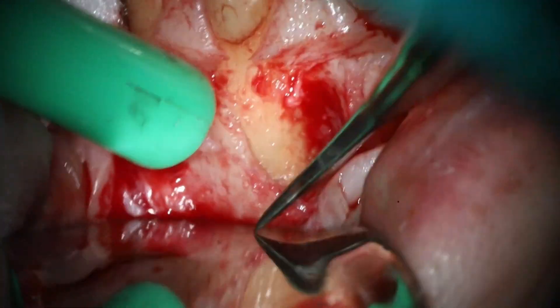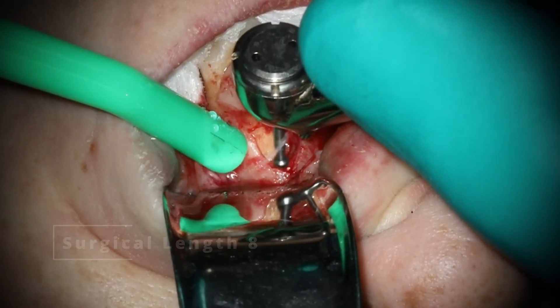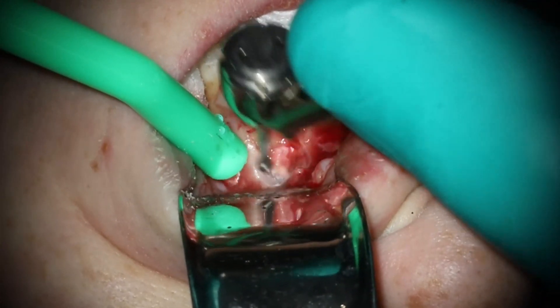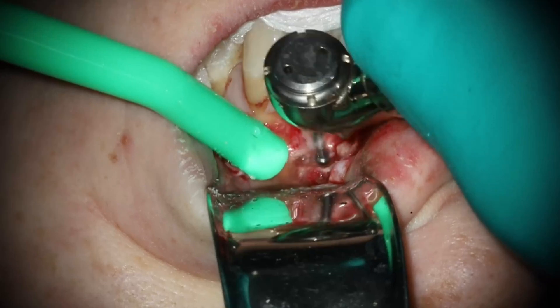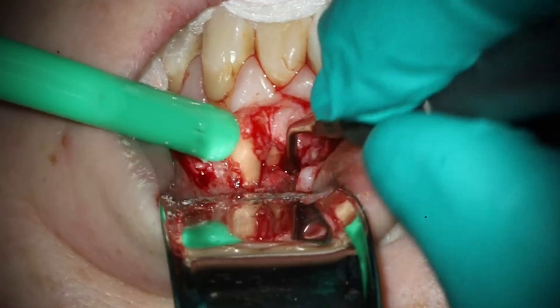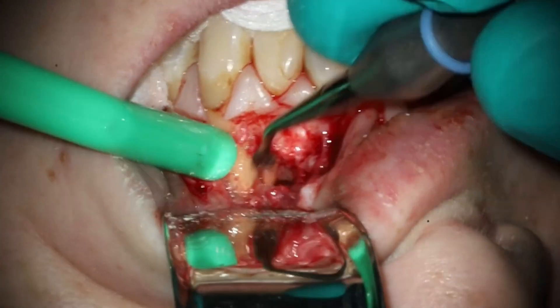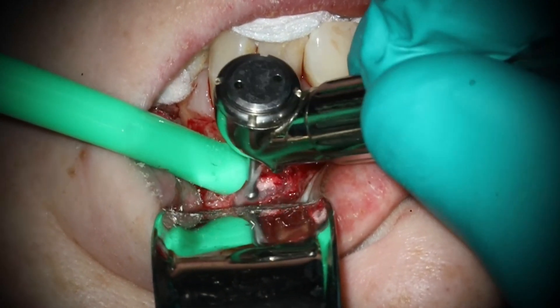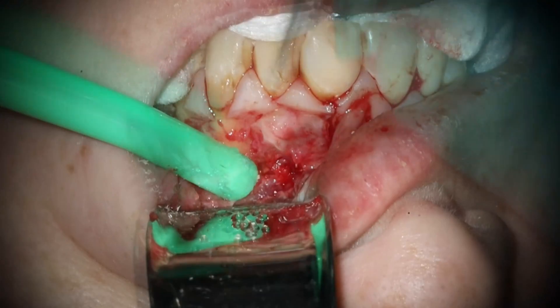I'm trying to be as conservative as possible when it comes to removing the root tips, especially if I'm going to be grafting. I feel okay opening up a larger hole in the bone to conserve more tooth structure. The bone will heal back up, especially if you're doing a graft, so I'm not as concerned about it. If you've been struggling with your apicos — I am very, very keen on minimally invasive endodontics being the way of the future — but with surgery you can make a bigger hole in the bone. It's going to come back.